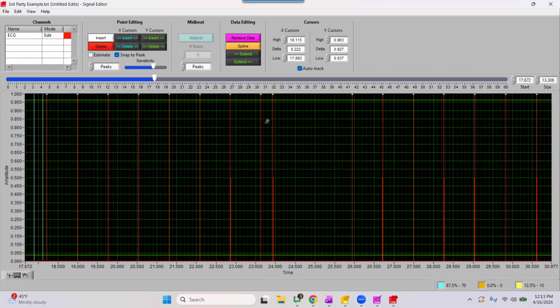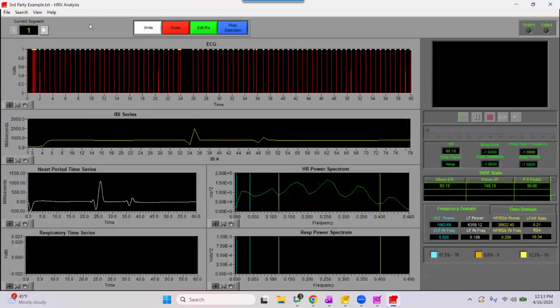So instead, when considering third-party devices, if you only need an estimation of heart rate, that may be fine for your purposes, especially if you're doing more ecological assessments outside of the lab. But generally, if we had purchased this device with intention to do pulse transit time analyses with ECG, no way, not happening at all.